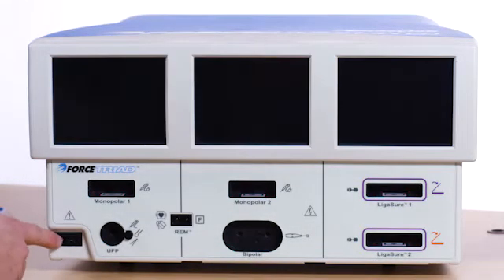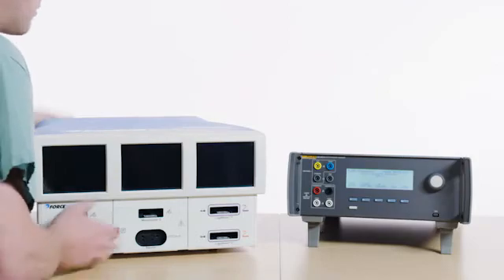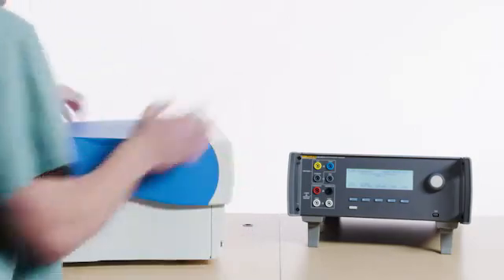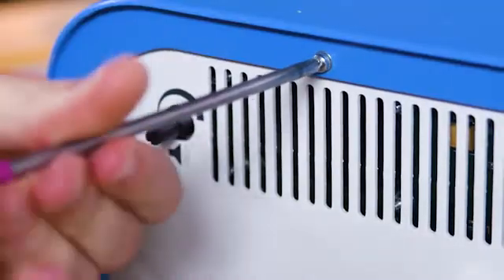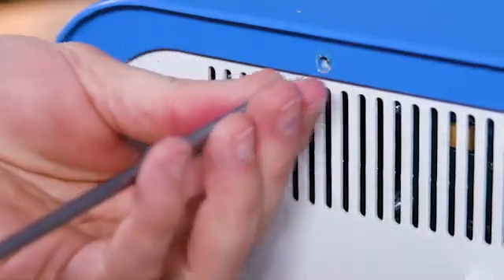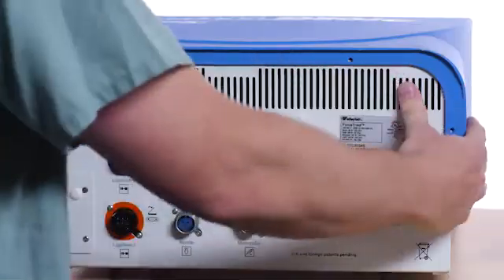Make sure the Forced Triad is off. Remove the four screws securing the chassis cover. Remove the cover.